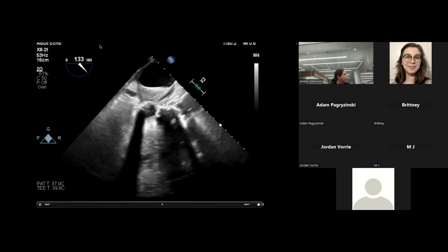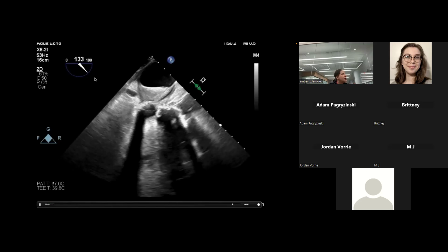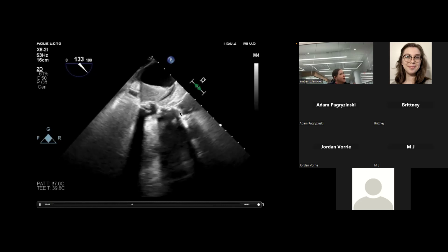Look at your omniplane to help you. Not RV. So you know this clot's still up here in the LA, right? What does this look like here?